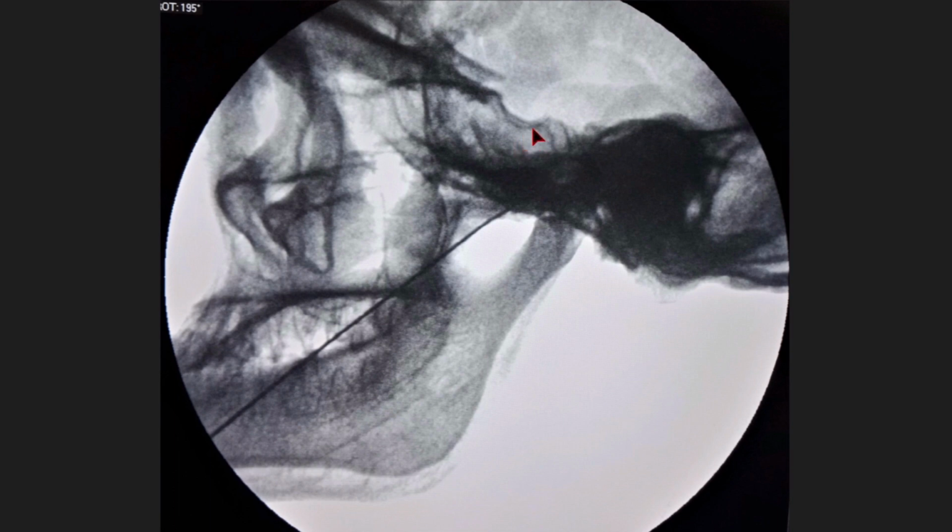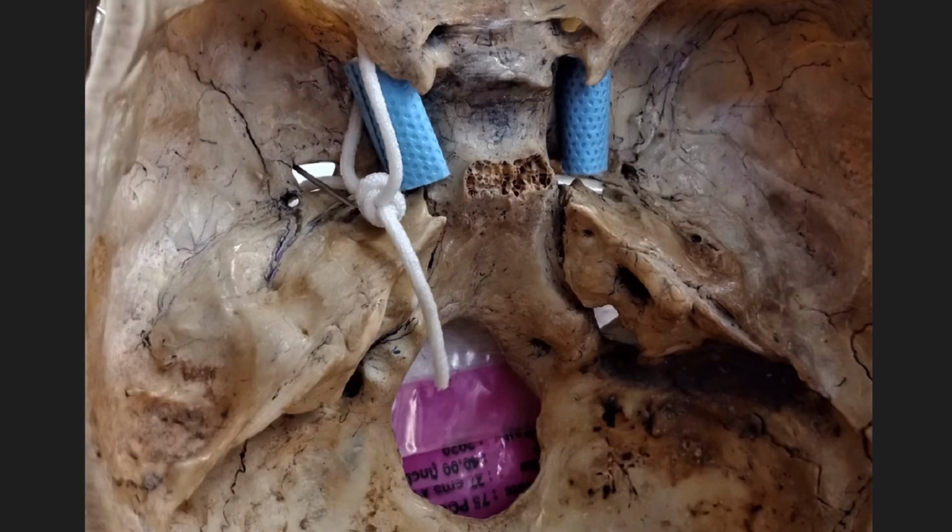So you can imagine here, this is the lateral part of the sella turcica where the cavernous sinus is, and all the lateral structures, and through the cavernous sinus we have already seen the internal carotid is going. Now the needle is taken almost up to Meckel's cave.